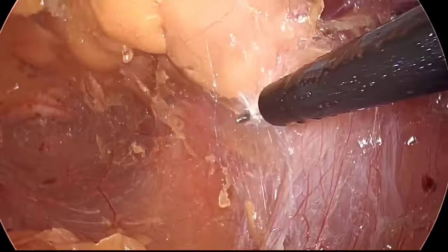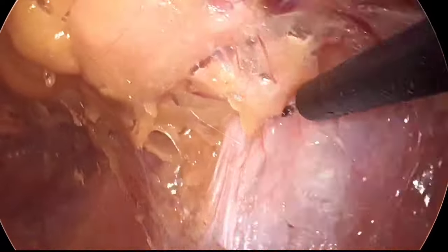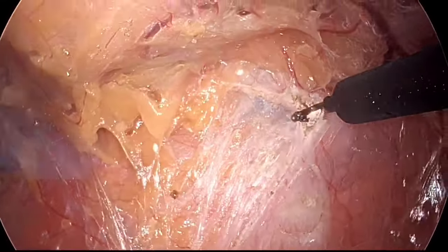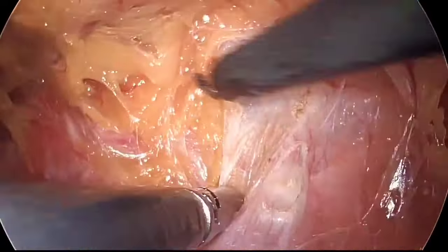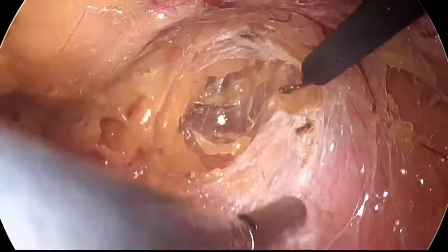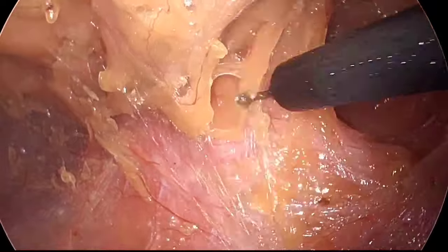So a little bit of the space of Retzius is created, and then coming onto the lateral side, just lateral to the inferior epigastric vessels. This is the posterior rectus sheath which is going up to the linea semilunaris, and just below that I am dividing the posterior rectus sheath on the lower aspect to gain access into the space of Bogros on the right side. So now you can see once I have divided, a little bit of further division will help me to gain access into the space of Bogros, and it is gradually created.